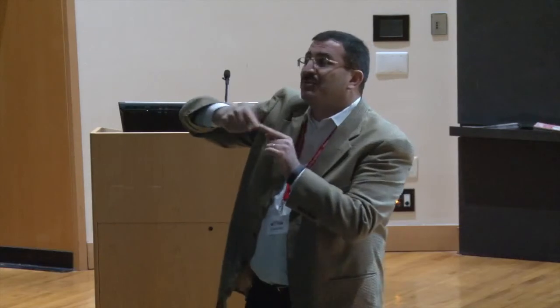I'll criticize my own work from the 90s. That was not true with our one-dimensional formulation that we had back in 95, 96. The regularization was not as well behaved. But with this one, you basically increase it and it's monotonic. So that's what I was pointing out, that the operator does not need to be an ultrasound expert or a signal processor or anything. He can just use it. On the other hand, we can actually intelligently find beta based on actual system performance.